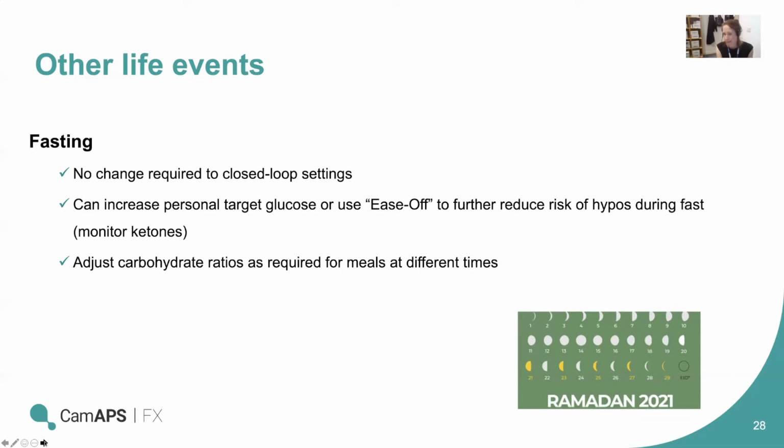One thing you might also want to think about, if you're eating your main meals at different times of day, so often later at night, is that your carbohydrate ratios at those times may not have been recently adjusted. So it might be worth reviewing, and we've covered this in previous webinars, what's happening with closed loop insulin delivery after a bolus, just to see whether those ratios need to be adjusted. Because your insulin sensitivity is often slightly different overnight. So just have a review of that.